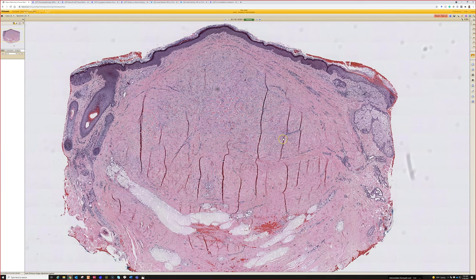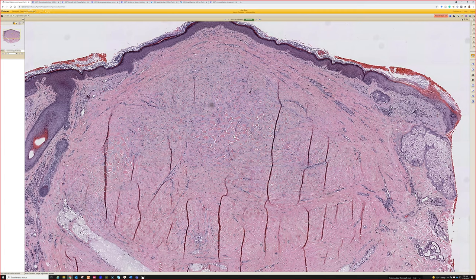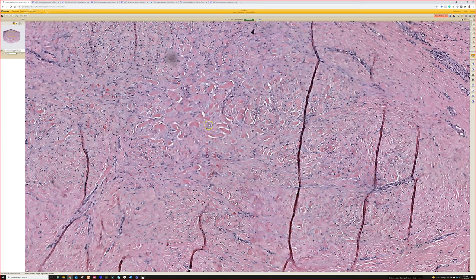This is a keloid, or in my opinion, hypertrophic scars can look very much like keloids. Some people disagree and say they shouldn't have keloidal collagen bundles. But keloid and hypertrophic scars get these big bundles of collagen. The distinction mainly is made clinically — if the keloid expands beyond the boundaries of where the scar was, it's a keloid; a hypertrophic scar stays within the boundaries.